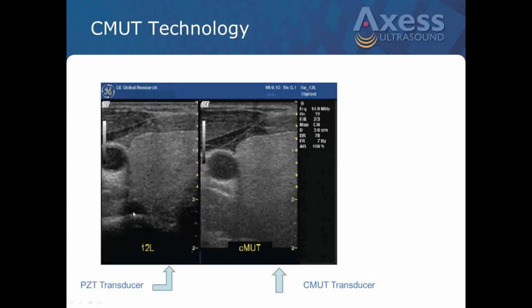You can see here, and I just don't know, is it the future of ultrasound arrays? Right now, one of the problems with CMUT, and I think it's been one of the holdups, is they're having a lot of trouble getting proper Doppler signals, pulse Doppler signals, using CMUT technology. They can do color, but that's got some problems too because it's still the Doppler effect. So it's still out there. There's a lot of research facilities working on it. There's companies working on it, but where it's going to go, I'm not sure.